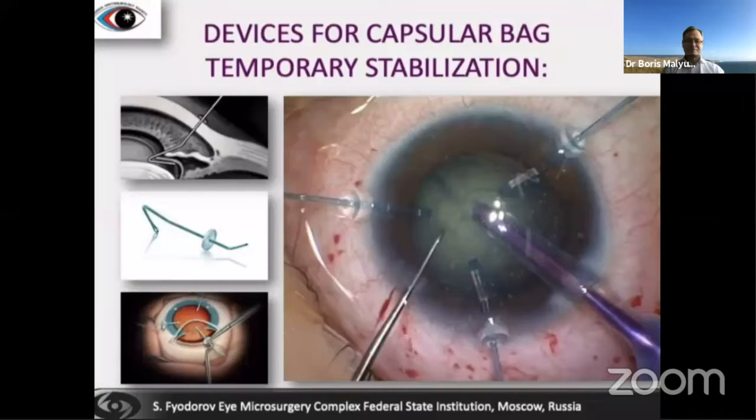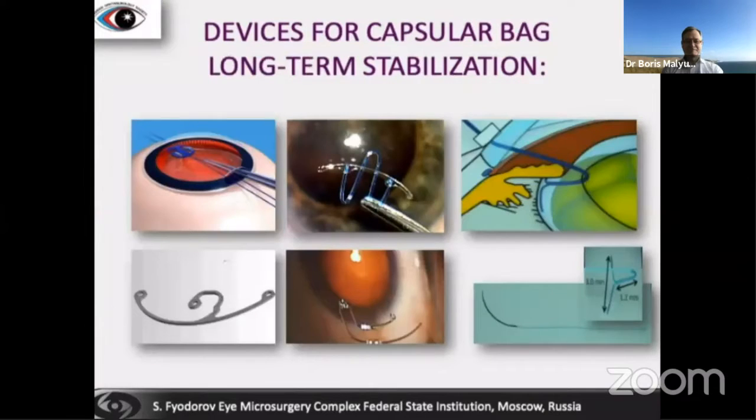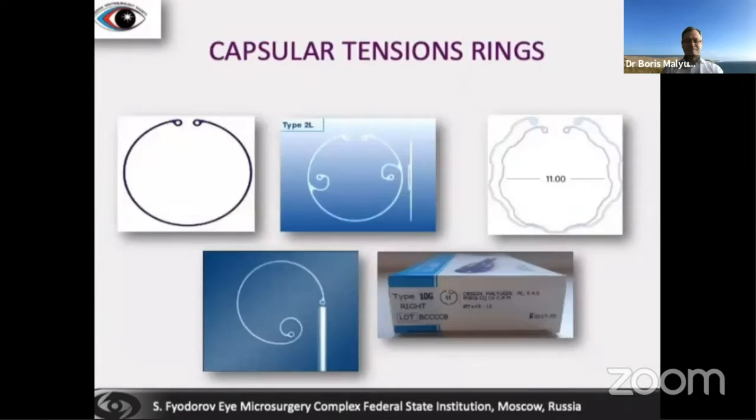There are several devices that can help us to stabilize the capsular bag during surgery, such as capsular hooks. There are many useful devices that can be sutured to the sclera and provide long-term capsular bag stabilization. Capsular tension rings of various types are among the most popular. They can be utilized in a variety of clinical conditions, from relatively mild to very severe zonular instability.